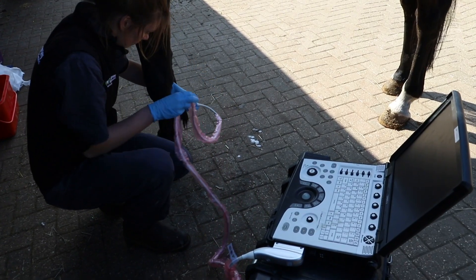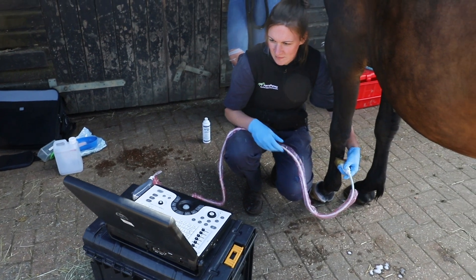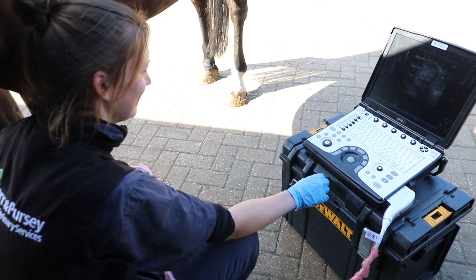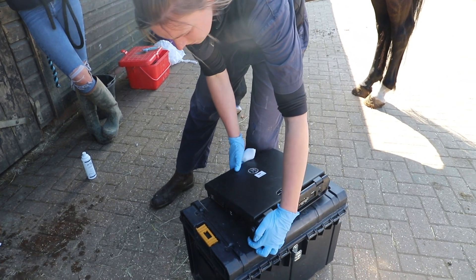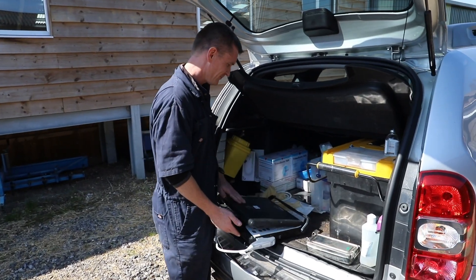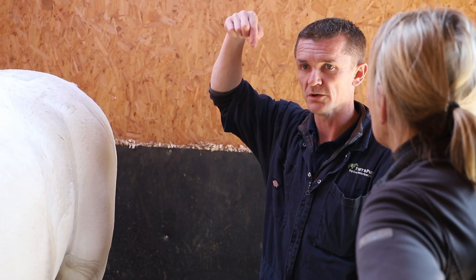I don't like wires around horses, so having something plugged into the mains is just one extra thing that could potentially go wrong. Upgrading to the R7 is money well spent. I have to think about safety, efficiency, and making sure it's cost effective for the practice. BCF — or what was BCF and now IMV — have helped us get our practice up and running and be competitive in what's now a customer-focused industry.